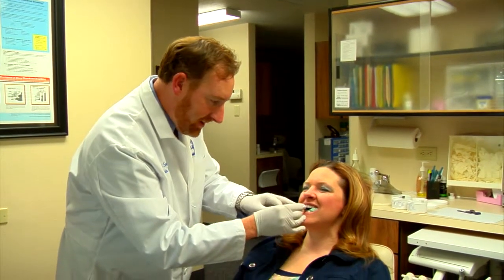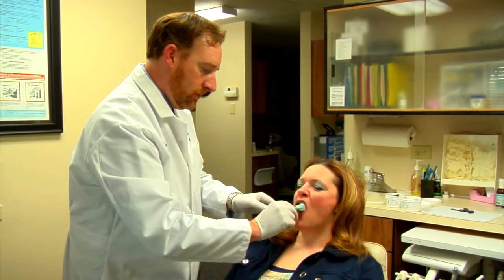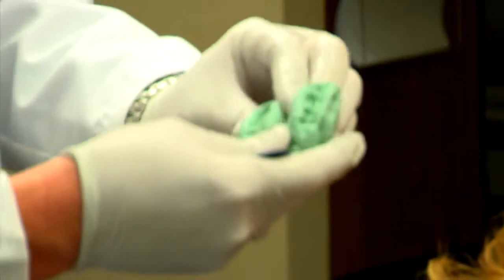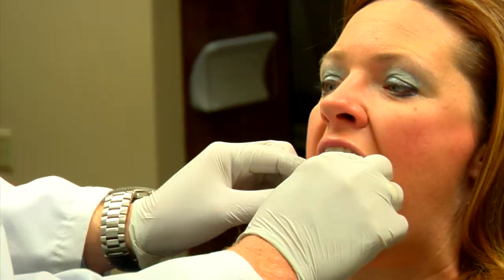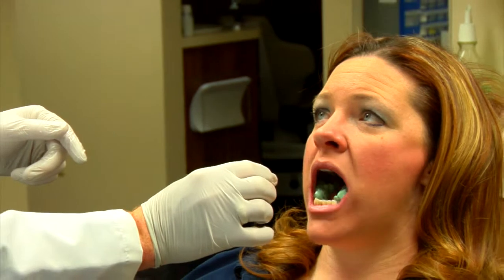I'm going to check and see if that's about set. And that is set, open. Okay, that's pretty much it. So you see the indentations on the teeth there, top and bottom. There's really nothing for me to trim in this case. So I'm just going to try that back in and make sure it fits all right. Close. And that's it. So if you're just trying to relax there, that'll keep the jaw from falling back. Go ahead and open for me and close.